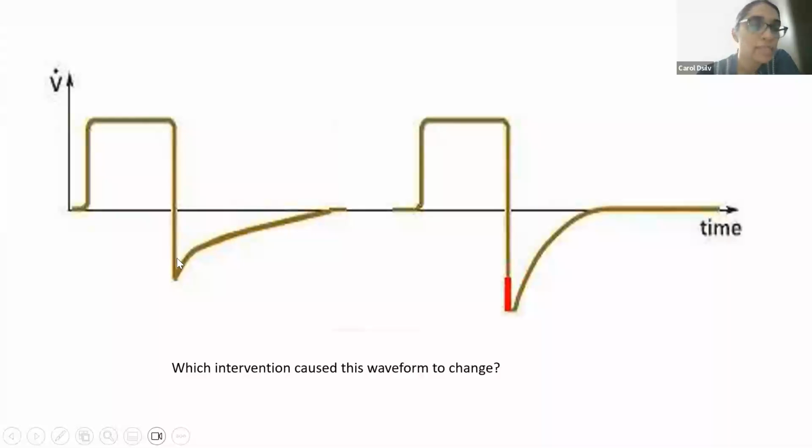What's the maximum expiratory flow rate? Okay. So in which condition will this peak expiratory flow rate be reduced? And it takes a longer time to reach the baseline. So the person who said that there's some airflow limitation here, it is actually reaching the baseline, so you've probably set adequate time for the expiration. Okay. So I do agree with the people who said that there is a decreased PEFR and it's taking a longer time for the flow to touch the baseline.